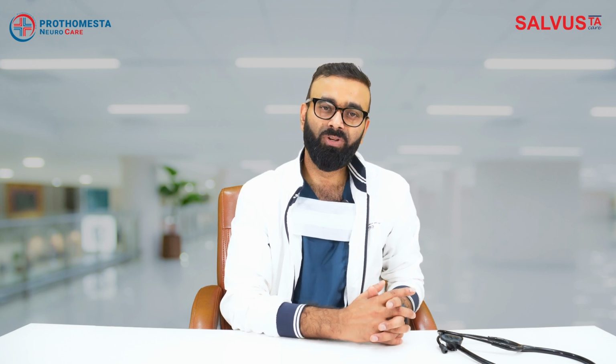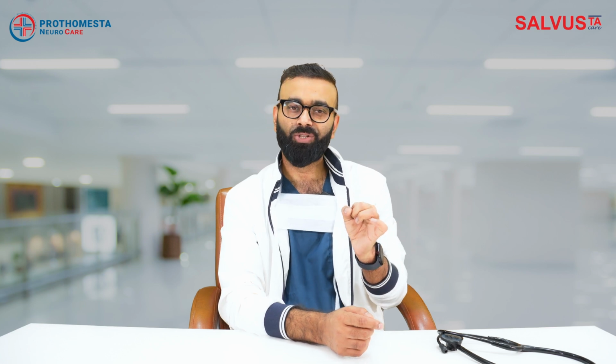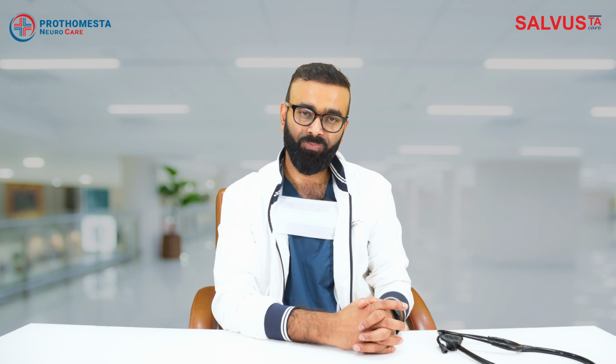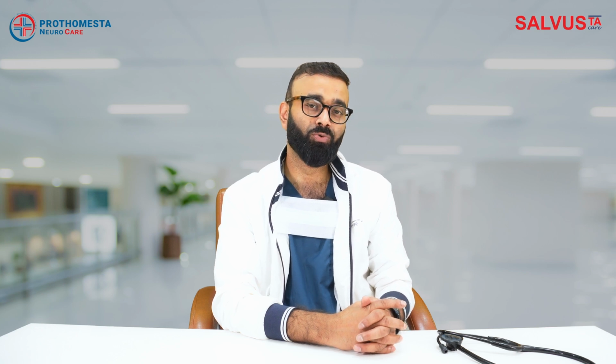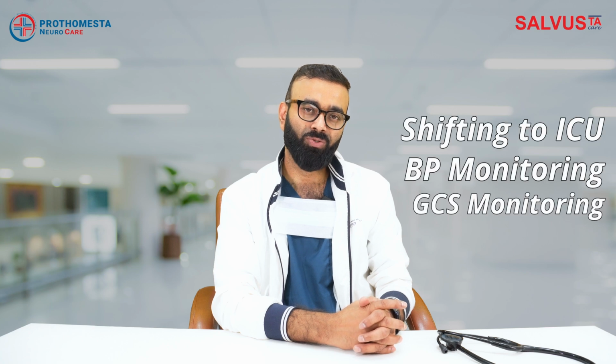So the first 24 hours is very crucial actually, because it is a simple matter. You have a very tight stenosis, you are opening that area, so there will be a gush of blood, a huge amount of blood flowing inside the brain, which can sometimes give rise to oozing of blood into the brain, causing bleeding. So that can be life-threatening sometimes. So we need to take care of that, and that's why we shift the patients to the ICU. BP monitoring, close monitoring is very crucial.